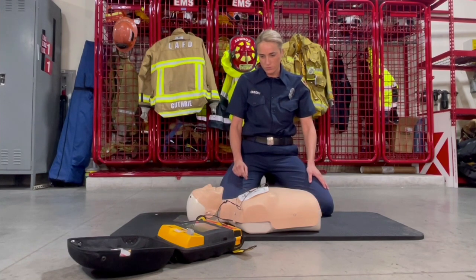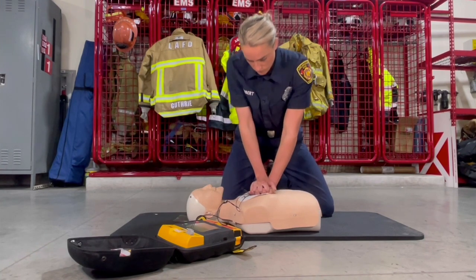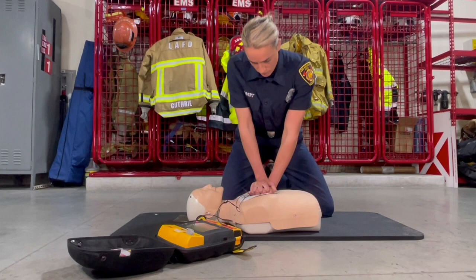After delivering the shock, or if the AED says no shock, resume CPR. Continue this process following the AED prompts until medical help arrives or the patient starts breathing normally.